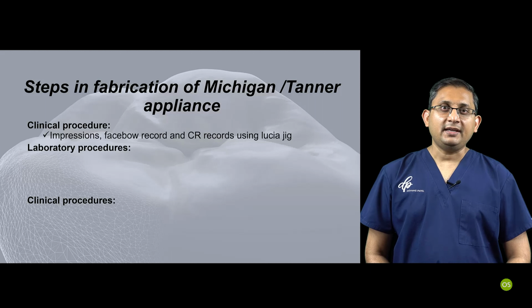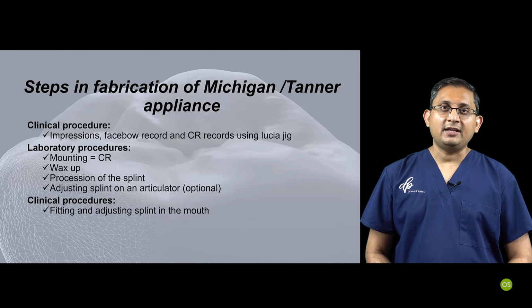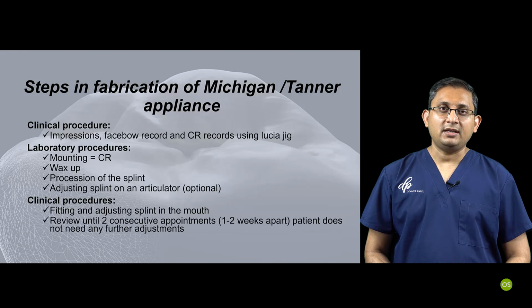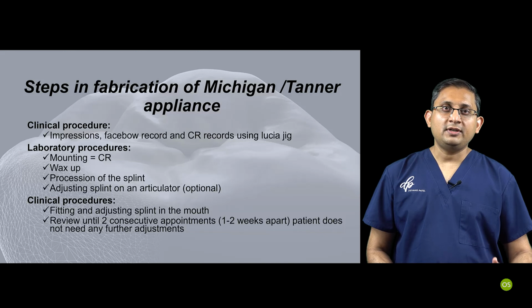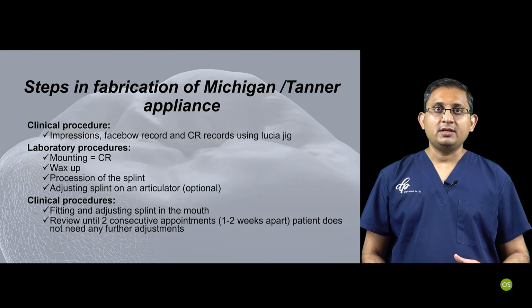The next step is you send all this information to the technician, who will then mount the models in CR, wax up, process the splint, adjust the splint on the articulator, and return the splint back to you. You then adjust the splint in the patient's mouth and review the patient in 1 to 2 weeks' time until there is no further adjustment. So ideally, you will only be doing clinical steps. The middle step, which is done in the laboratory, you will not be doing in your clinical practice.